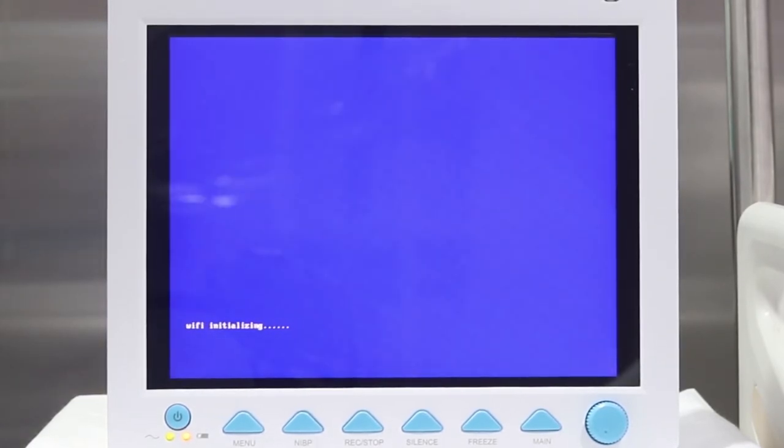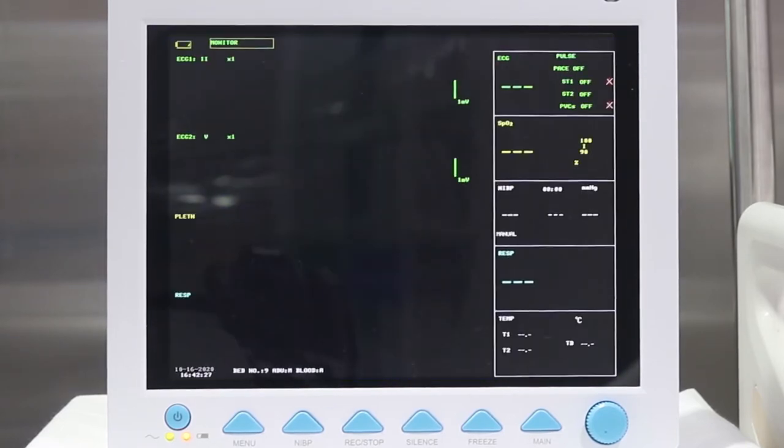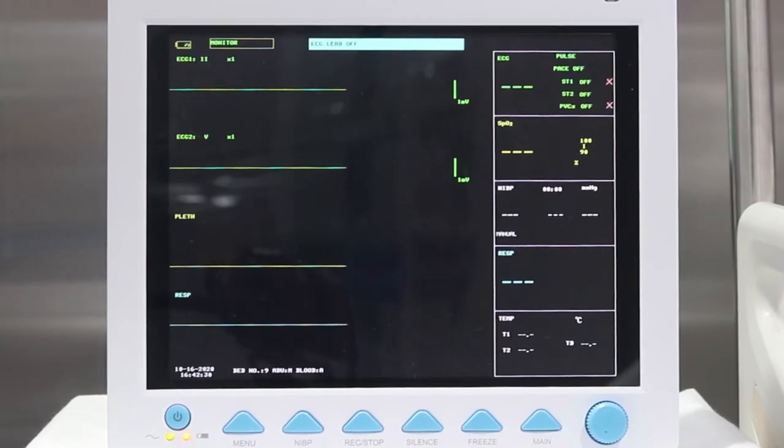Screen Display: The display screen can be divided into three parts. Information area at the top and bottom of the screen, waveform or menu area displays eight waveforms and menu options, and parameter area to the right side of the waveforms.